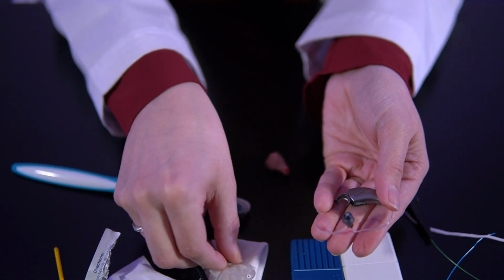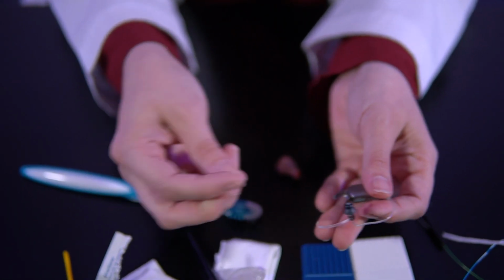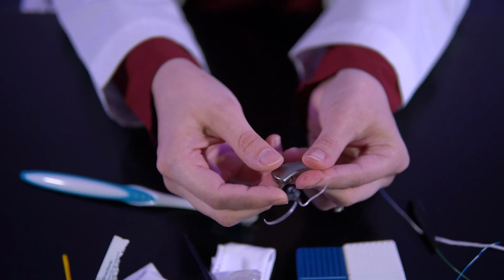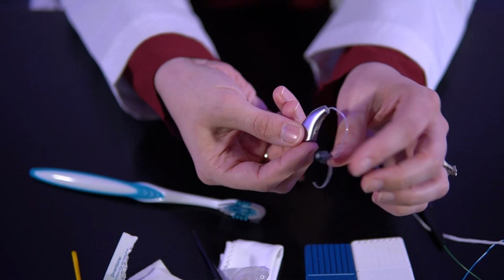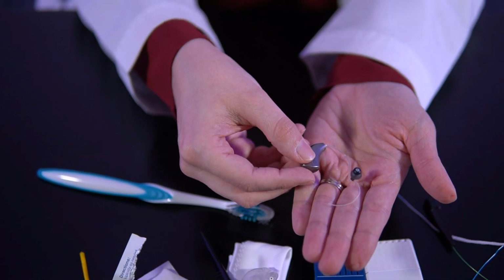And then if you open and you get a new battery, we're gonna take our battery, for those who need it, put it back in, and we'll close our door. And then we hear our startup jingle, and you're all good to go again for another week.